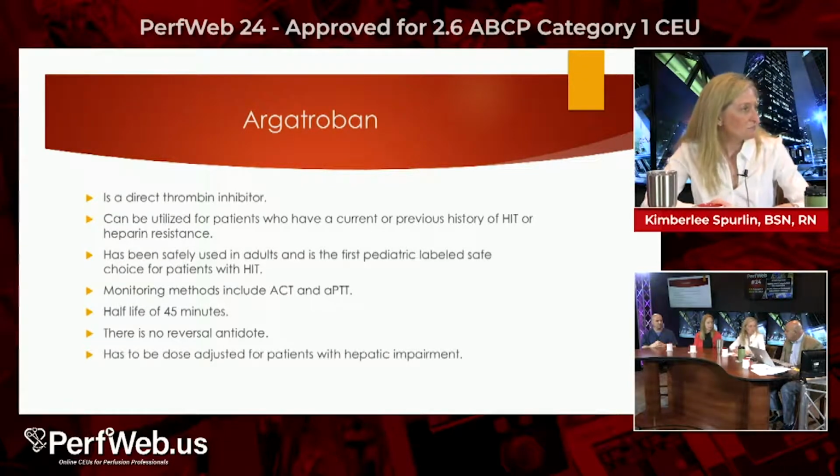And static blood will still clot. Yeah, the blood has to be moving. If it just sits there, like a lot of our connectors, if you're not sampling or flushing ports hourly or whatever, you have to be very diligent with that. Sorry, we didn't mean to interrupt you. No, you're good.